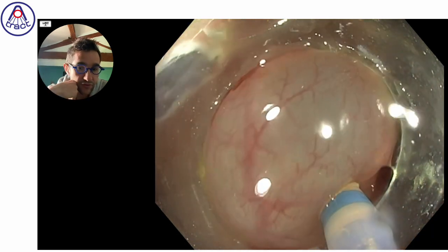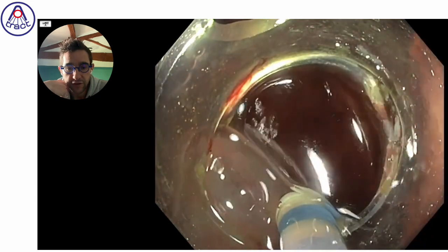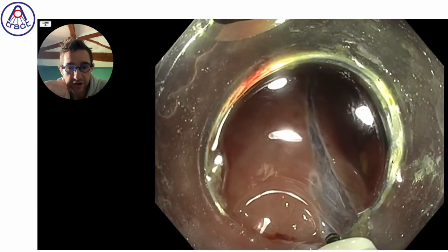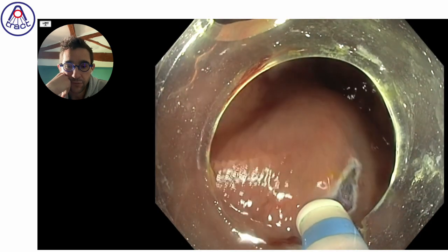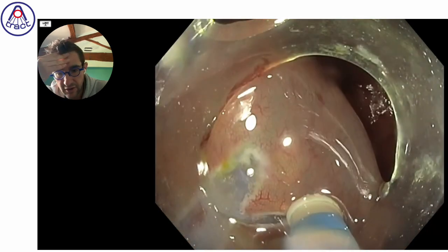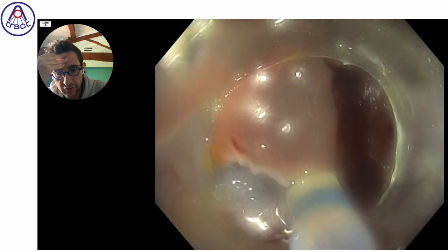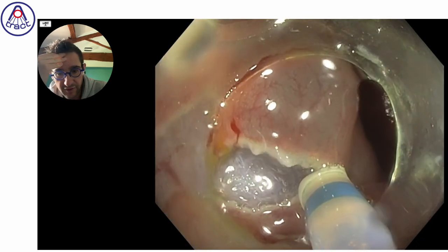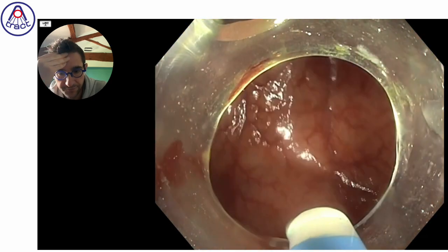It's not so easy to go there, and therefore it takes a little more time, a little more energy. It makes you less comfortable. So please avoid this by adapting your strategy with the new cases you will do, in order to avoid this kind of mistake that makes your resection a little more difficult.